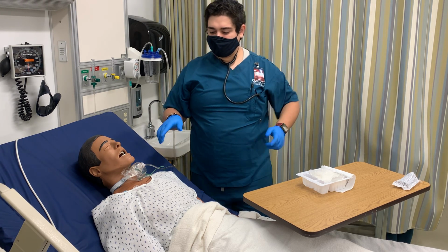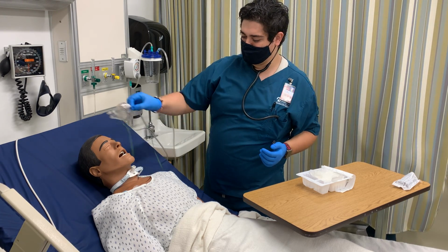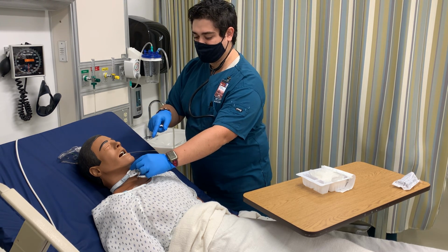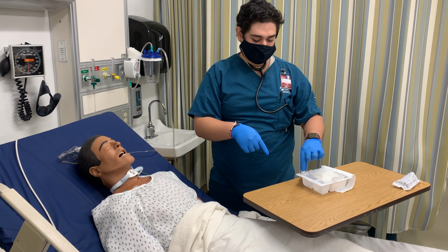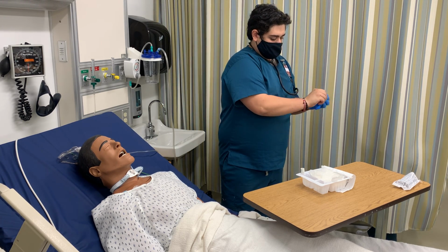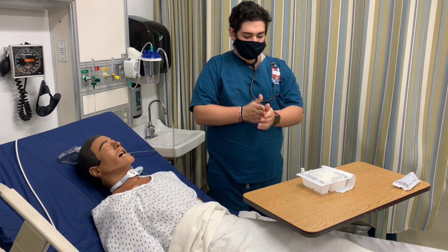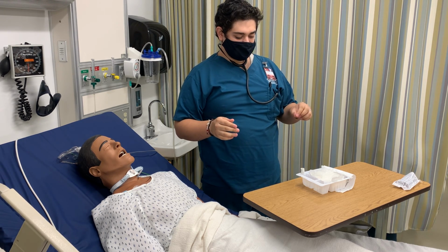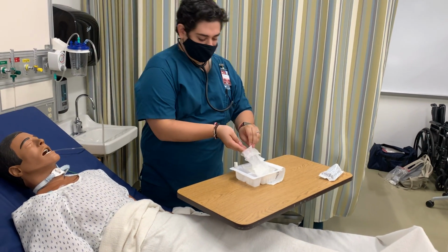So now that Mr. Doe had a couple minutes to catch up and re-oxygenate, I will be removing this, making sure that I'm only touching the white part of his inner cannula, replacing it, and I did fill these with the sterile solution earlier. Have that set. Remove my clean gloves. Hand hygiene. Now I will be applying sterile gloves.